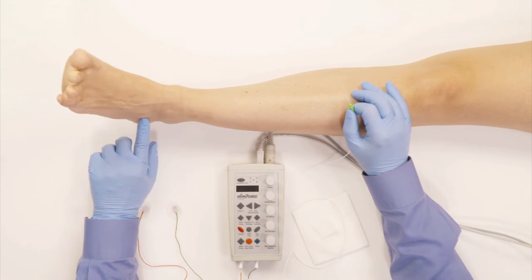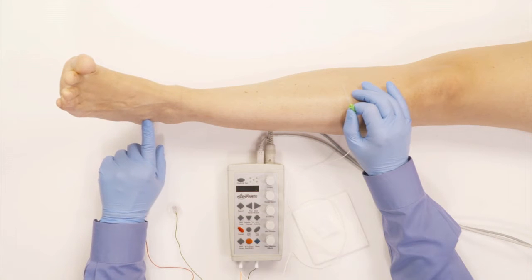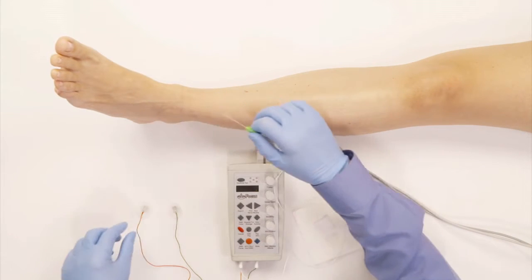So I ask the subject to bring your toes upwards, and here I can see the muscles very clearly, and this is where I need to stick the muscle.